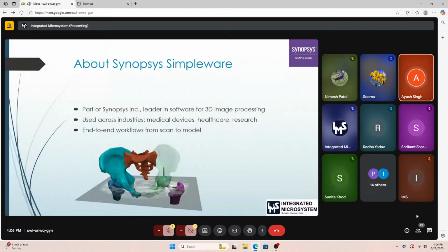So there's a strong need to support various import formats, and that is an advantage in Simpleware. We are not limited to DICOM or STL format. We have coverage of all the raw image dataset files. Apart from that, any volume mesh file, CDB, INP is also supported.